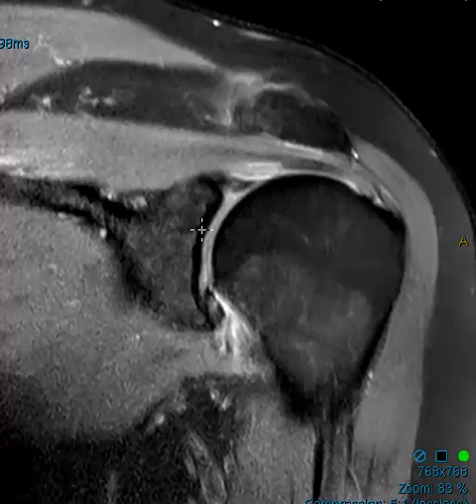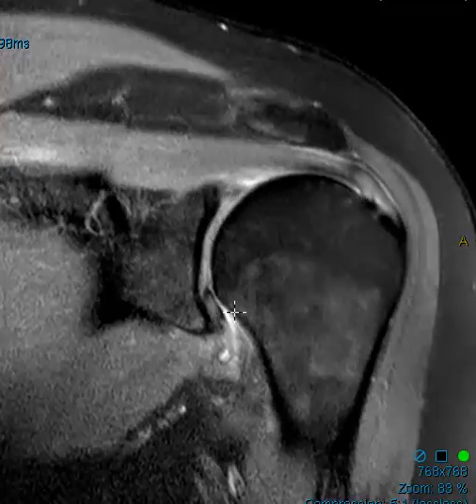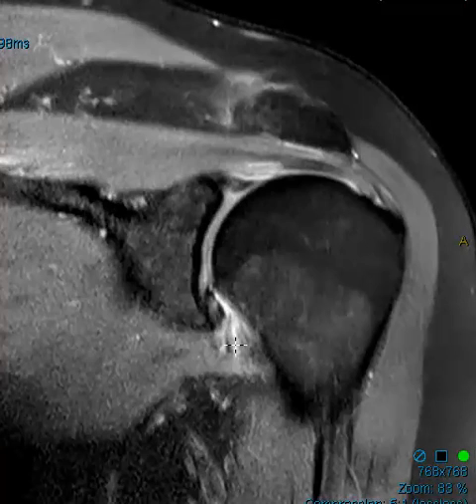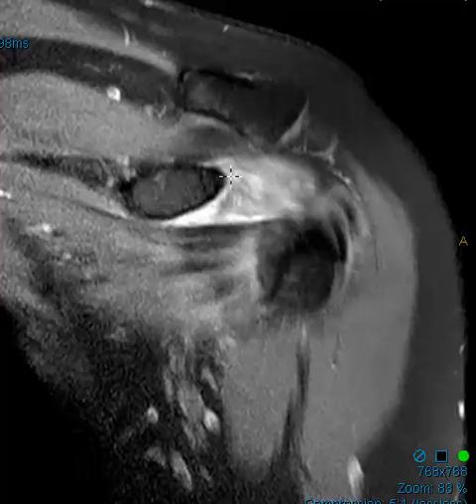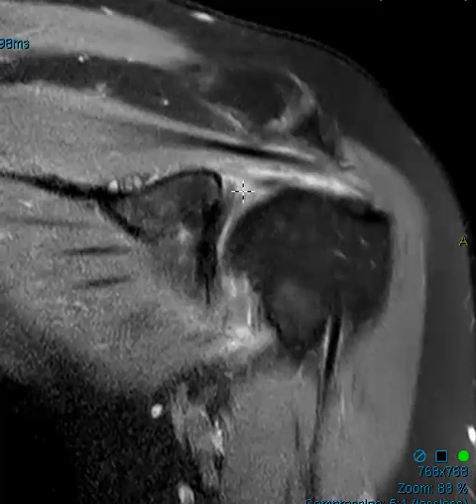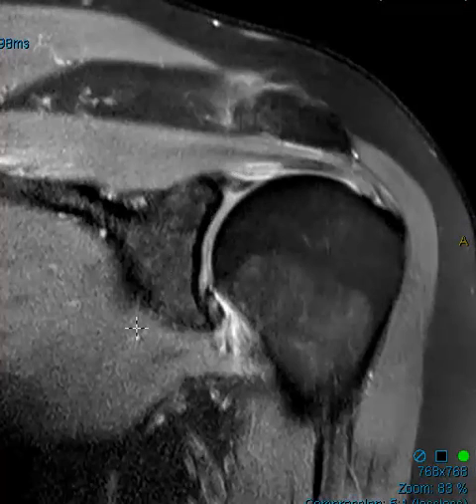Also look at the fluid — if there is a big joint effusion that would lean against adhesive capsulitis, but if there is very little joint fluid that goes along with it. They get this thick, inflamed joint capsule with very little or no fluid in the joint. Again, look for that little fat triangle here, see if it is obliterated, and think about adhesive capsulitis. Thank you very much.